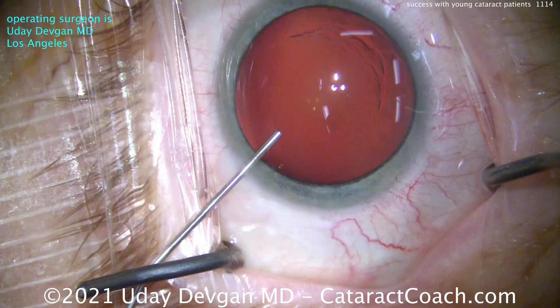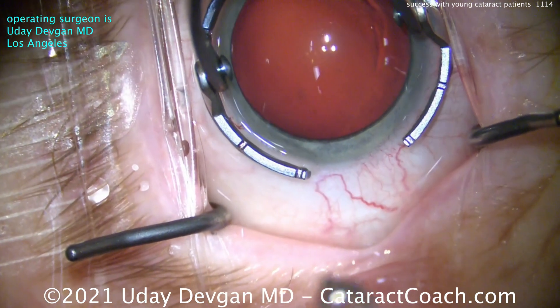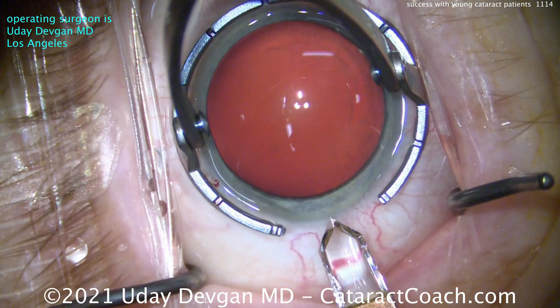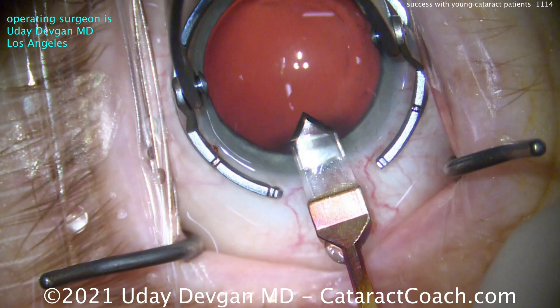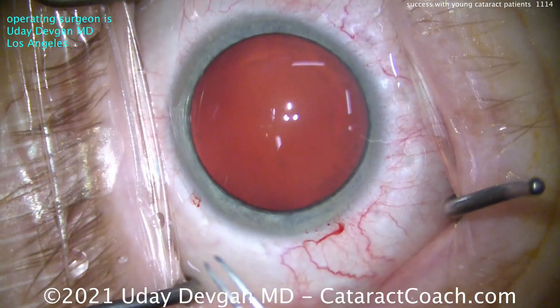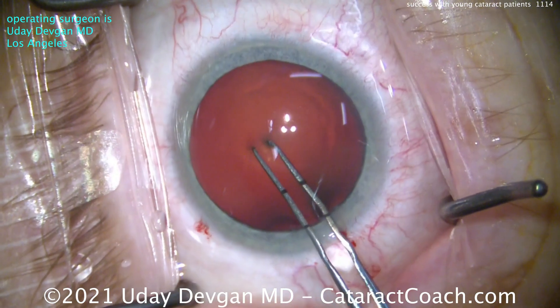At the beginning of the case, we're filling up our anterior chamber with our dispersive viscoelastic — that's to protect the corneal endothelium. Now this is a critical part: the incision. Use a diamond keratome; it's the sharpest and the best. Barely nick those limbal vessels to get a very good incision construction. That incision has to seal beautifully. Notice the little bit of bleeding from the limbal vessels — that means it's going to seal beautifully and seal forever.